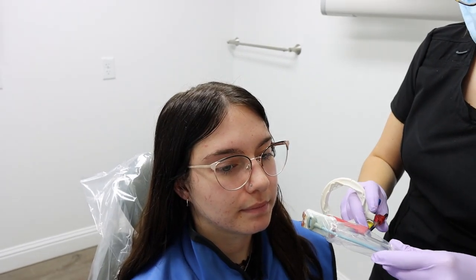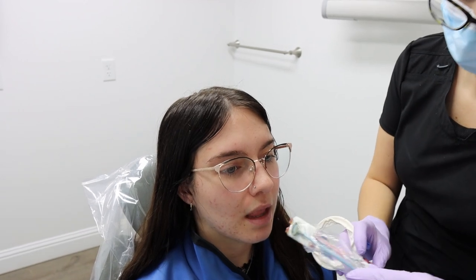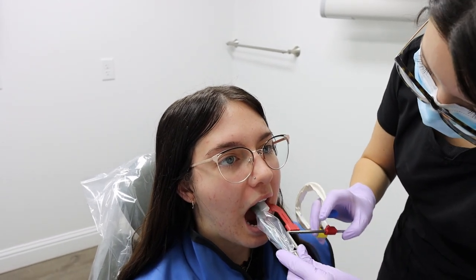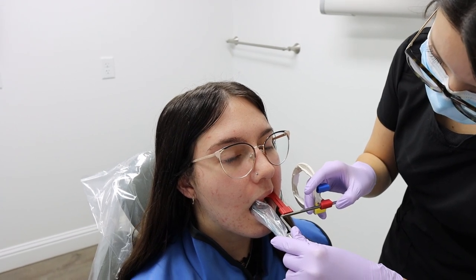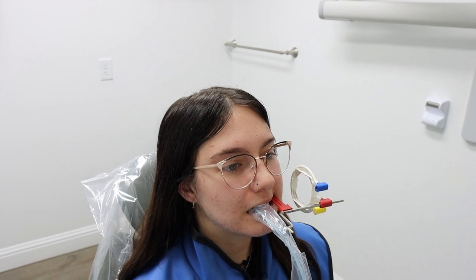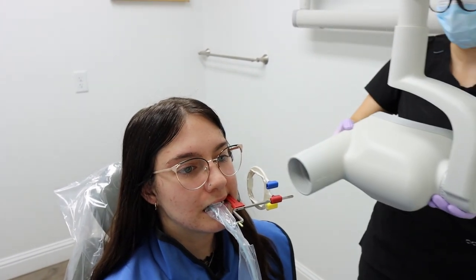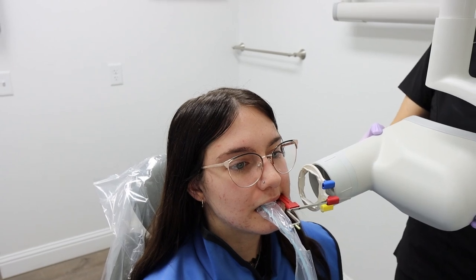For the last of the four bite wings, we're going to get the molars on the left side. Again, instruct the patient to open, make sure the sensor is parallel with the teeth, and instruct the patient to bite. Angle the x-ray head and line it up with the ring.